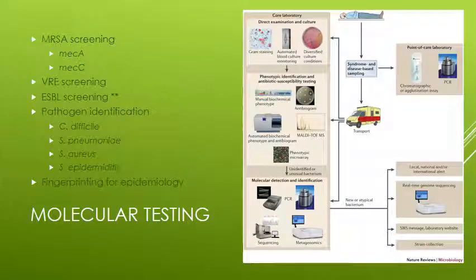And then, of course, we have to move to molecular testing because there's a lot more molecular testing in the microbiology lab than there ever was before. Most of it directed against emerging infections. If you don't have screening protocols in place for these emerging infections, meaning your MRSAs, your VREs, ESBLs, CRES, all of those, then you're not serving your patients well. There's several ways you can screen, but the molecular methods are things that hospitals really favor because we really appreciate the sensitivity and the specificity of those.